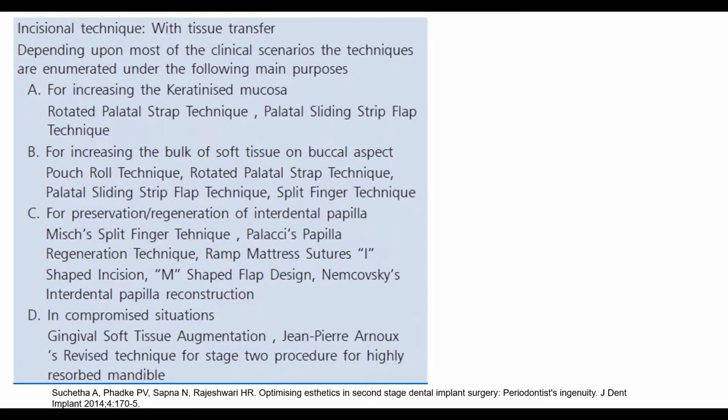The second technique is the incisional technique with tissue transfer. When the width of the keratinized mucosa is less, or to increase the bulk of the keratinized mucosa in the aesthetic zone, we need to follow this tissue transfer technique.